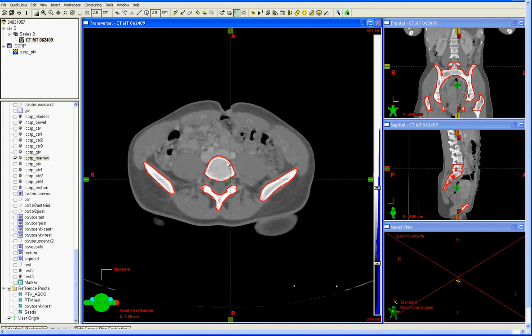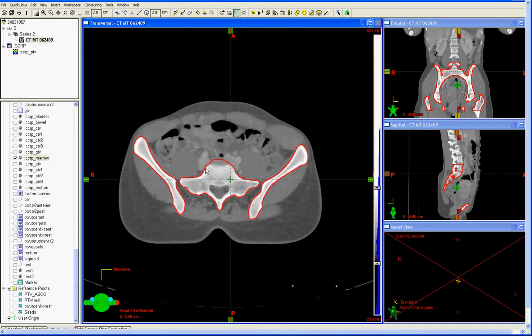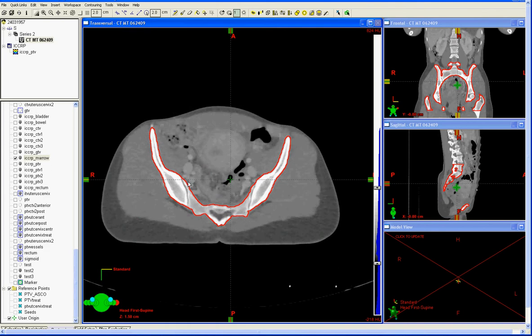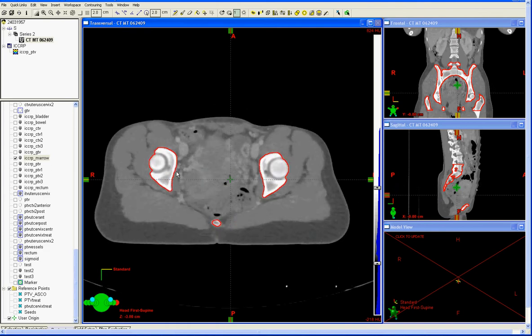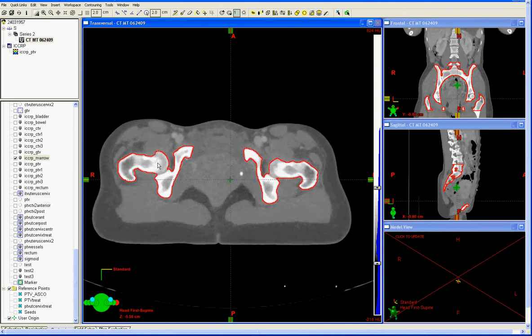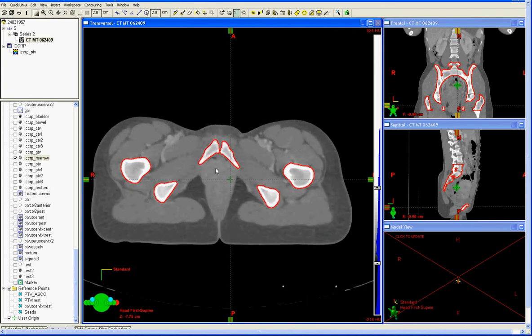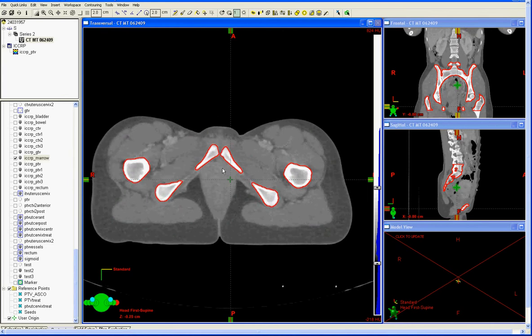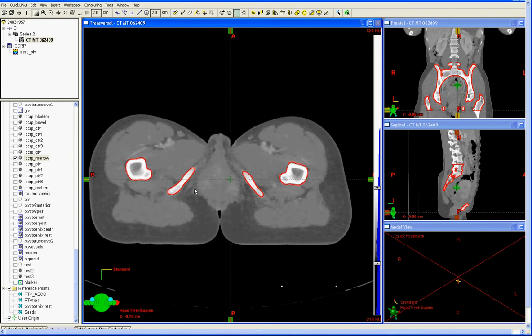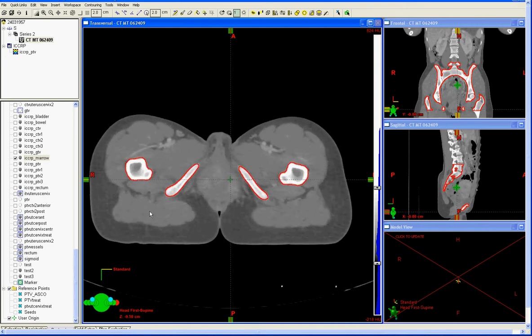We contour the entire L5 vertebral body, the ilium, the entire sacrum, the ischium and pubis, and the acetabulum and proximal femurs. All of these bone structures should be contoured down to the level of the ischial tuberosities, which should be the last slice on which bone marrow is contoured. At this level, the proximal femur should also be contoured, and that will conclude the extent of the bone marrow volume.